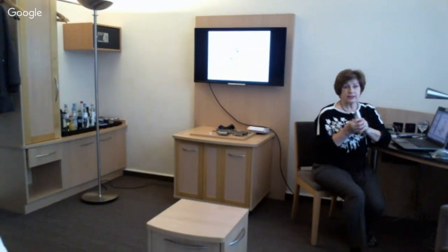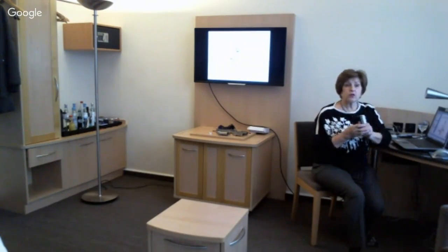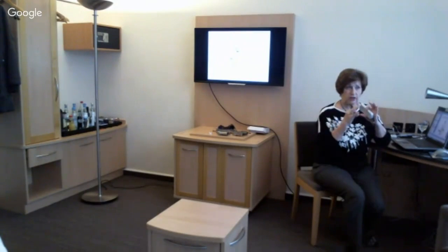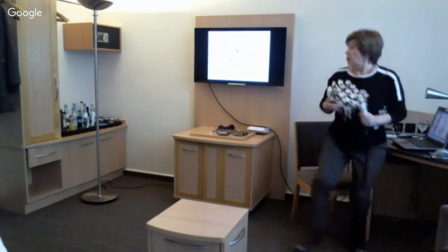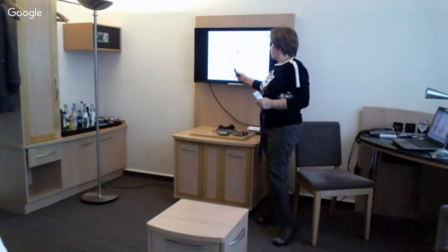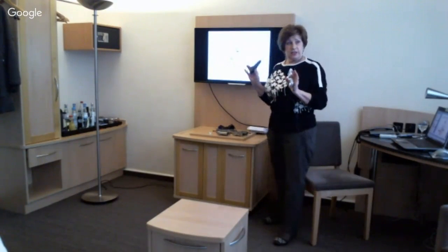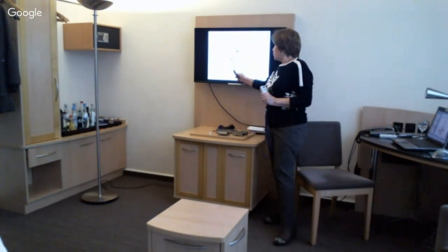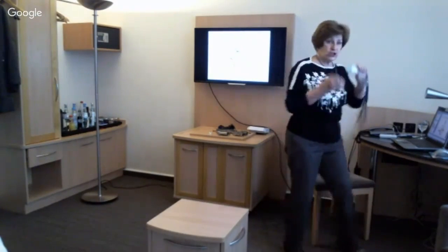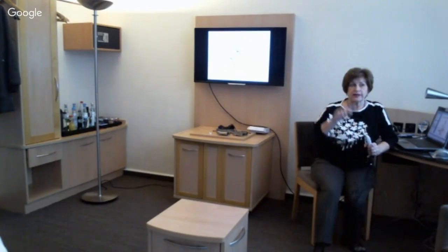Such a zone is constructed the same way. What we worked through on the zone, the point zone is constructed in exactly the same way. We cover this zone with the surface of one electrode and make it wider, one electrode wider in each direction. Thus, the zone of stimulation is bigger than this pain point. The rules are the same.